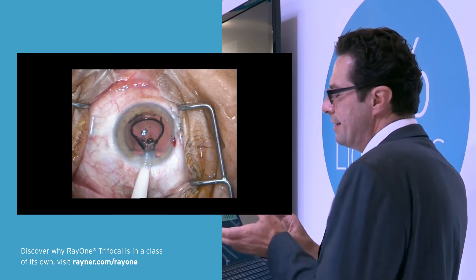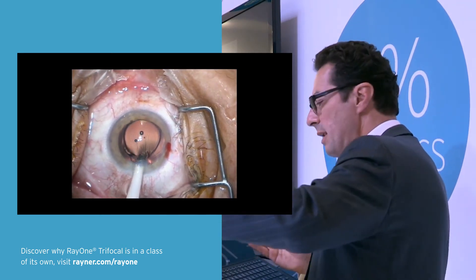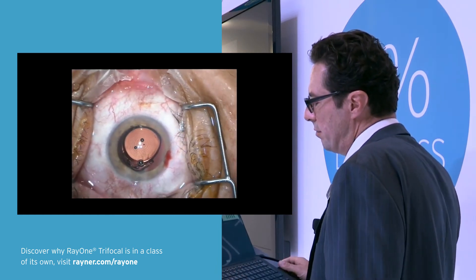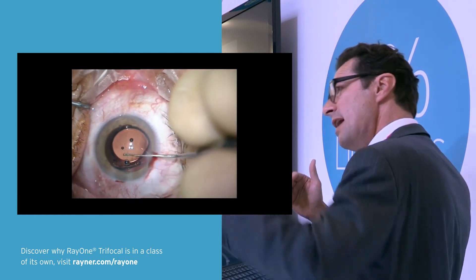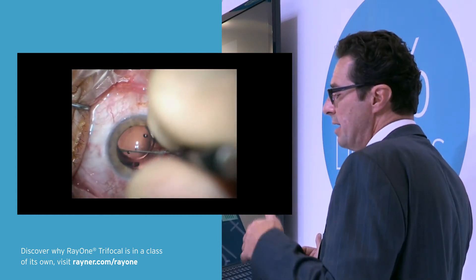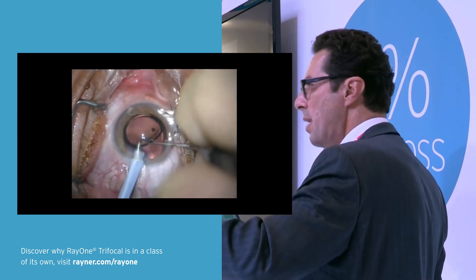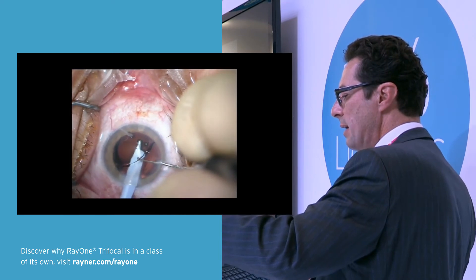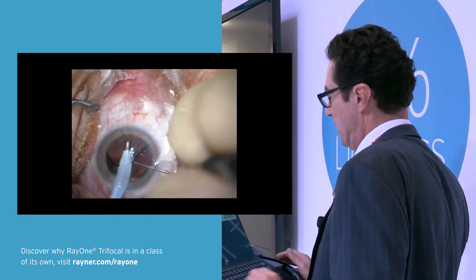Sometimes you may rotate the injector slightly to achieve a smooth and parallel implantation. I routinely aspirate the viscoelastic from behind first, so there is a pillow in front at the endothelial side. After aspirating the viscoelastic from the posterior part of the capsular bag, I remove it from the anterior side.